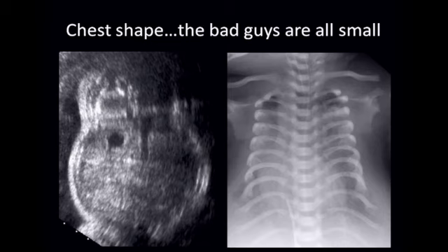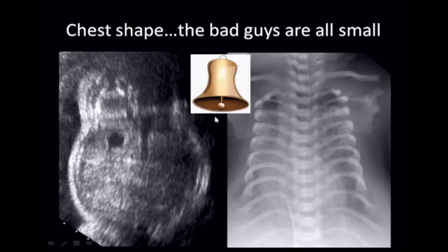And there's normative data out there for chest circumference and chest height for gestational age. But also, if you do a coronal image through your fetus, if the chest appears pinched in relation to the abdomen, that is described as a bell-shaped thorax. And this is a radiograph of this child after delivery, and you can see the chest is very straight-sided and then flares at the bottom. Ossification is normal, there aren't any fractures, but the chest is small and the ribs are short. They don't curve around in the normal way.